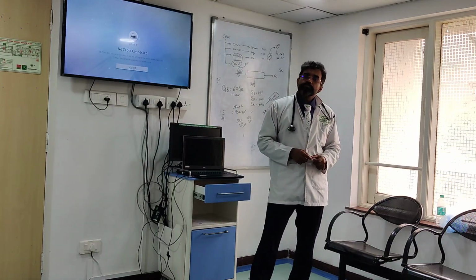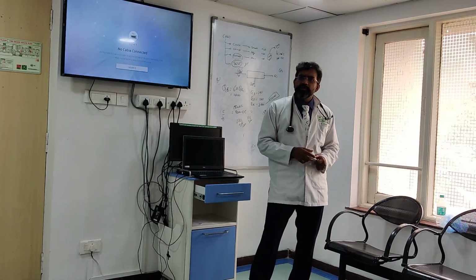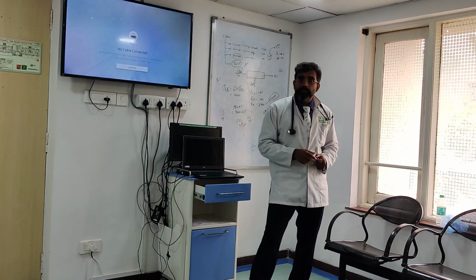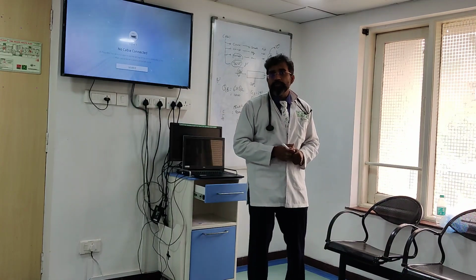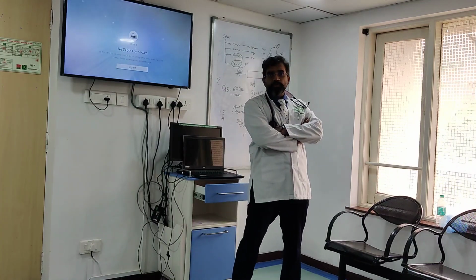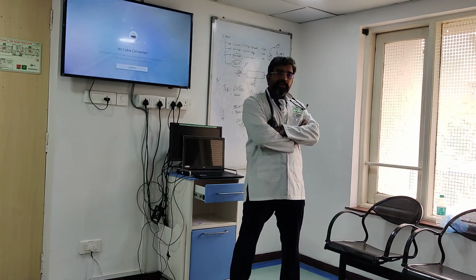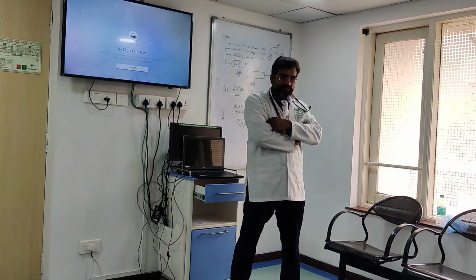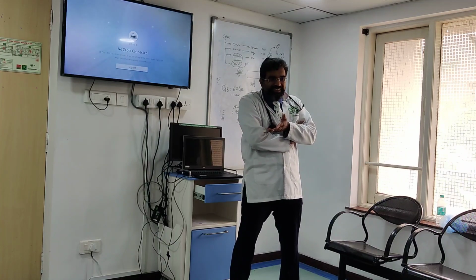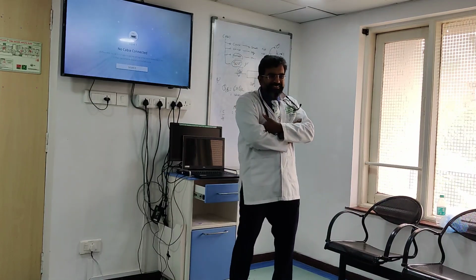So the blood flow, how much maximum we can go, depends on the blood pumps, so it varies from machine to machine, but you can go up to 450. Many of these machines give up to 450 ml per minute. It's in CRRT that this much flow is not allowed. He's asking how much you can go. You can go so much, but it's not allowed. It will become dialysis. If you can do 450 ml per minute, fast, you will do dialysis.